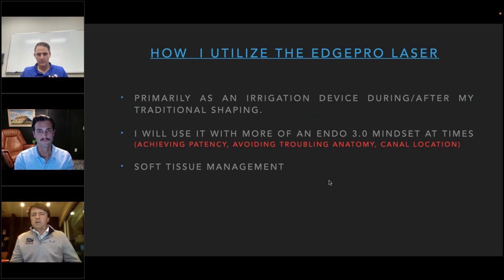How I use my laser, I'm definitely not as far along in this as Charles, that's for sure. Listening to him, I'm learning a lot even tonight, listening to how he utilizes it. I am much more vanilla in my approach, and I think that's the beauty of the device. Unlike the Gentle Wave, where you use it a certain way. This is the protocol, and I think there are things about that that are really good. But the great thing about the laser is you can use it however you want, within reason. And for me, at this point, it's evolving, it's changing. I'm branching out a little bit, but I'm very vanilla in the way I use it.